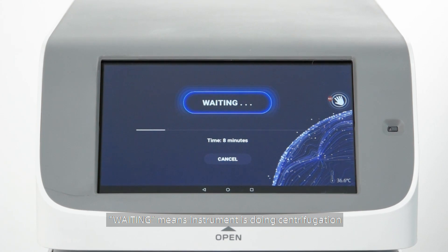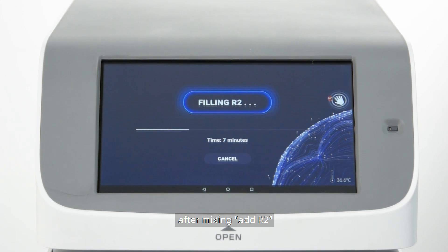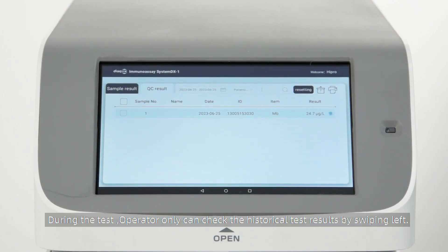Waiting indicates the instrument is performing centrifugation. After centrifugation at R1 and mixing at R2, the remaining test time will be displayed on screen. Do not press Cancel during the test.